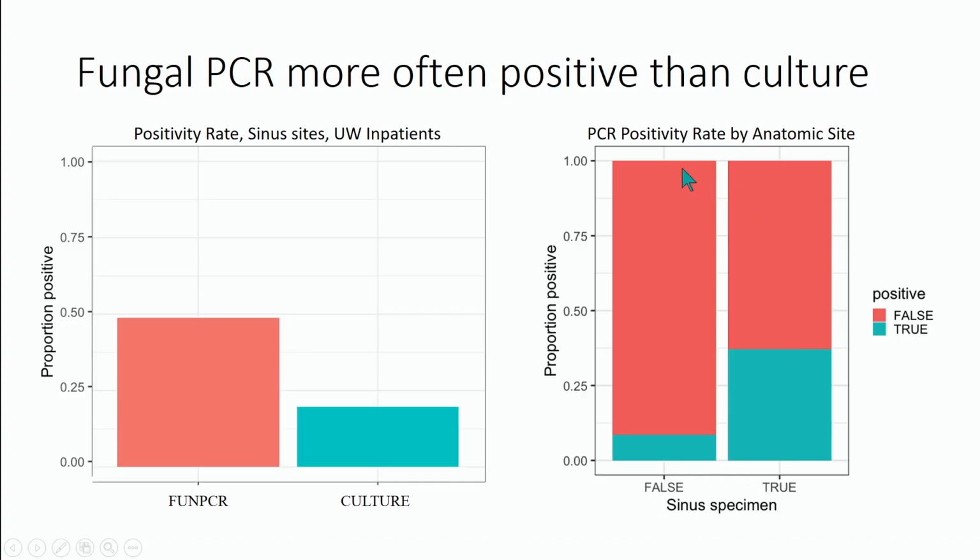And the clinicians would like to do broad-range fungal, mycobacterial, and PCR testing to rule out an infection so they can put the patient on steroids and treat their sarcoid. And so that emphasizes that while I can't quantify it yet, these negative results are actually still oftentimes quite informative, and it also explains why the sinus population, I think, has a really high positivity rate.